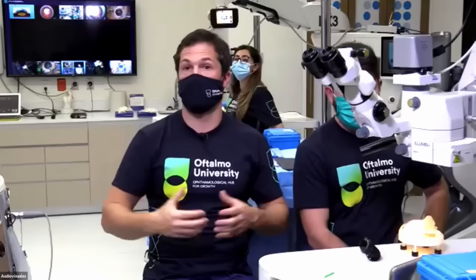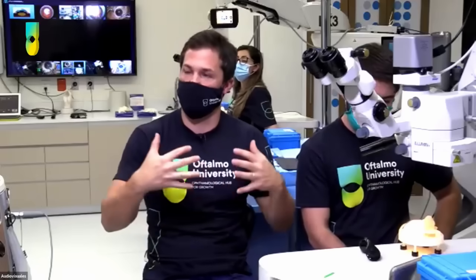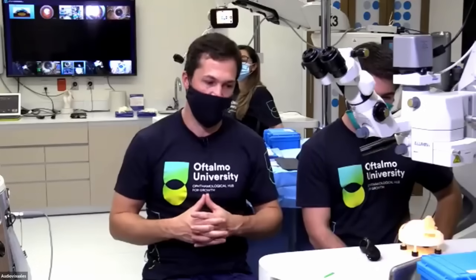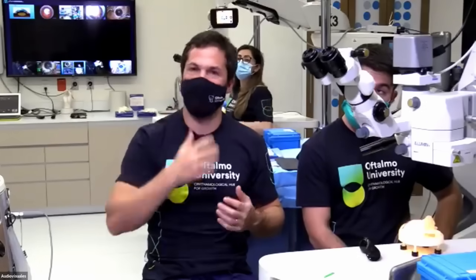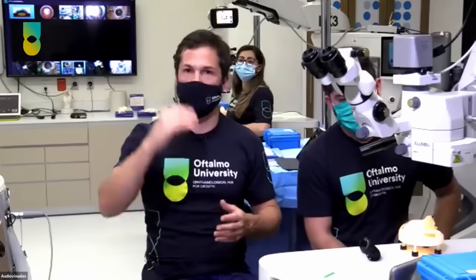Also, the balance tip: surgeons talk about the importance of efficiency, the protection of the incision, but also efficiency with the very hard cataracts that we have in Latin America. And finally, the hybrid tip. I would love for you, David, to tell us, in your opinion, what is the value proposition of these four technologies that you're presenting to people in training?